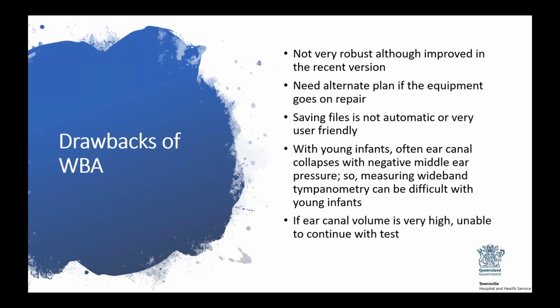What we found was that the saving of the file is not very user friendly. You can't just do the test and save it easily. You have to make a folder and then store the results. If you forget to do that and do the next patient, the whole list builds up, and there's no patient name attached to the file name. So you have to be a bit more careful, and it's not that user-friendly compared to saving the other test files. It gets better with practice, but it's not a quick or easy way to do it.